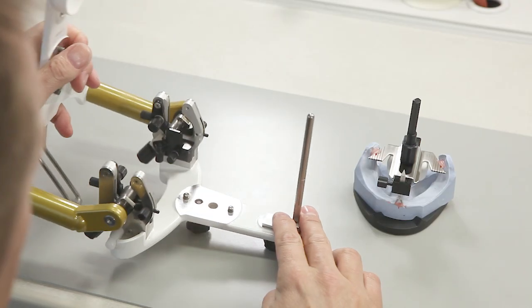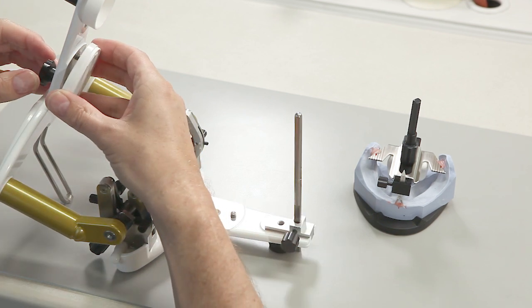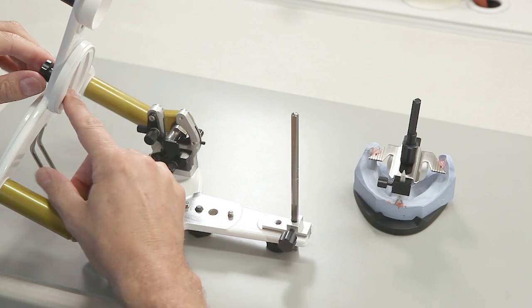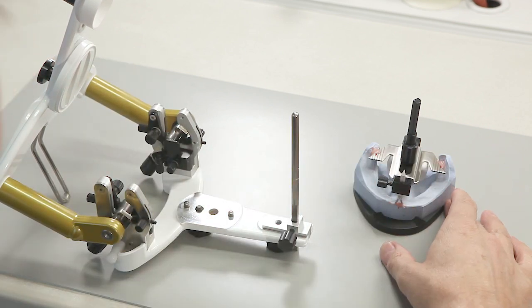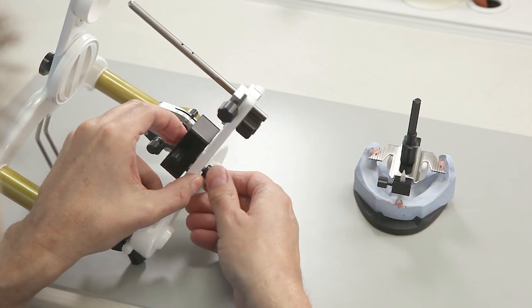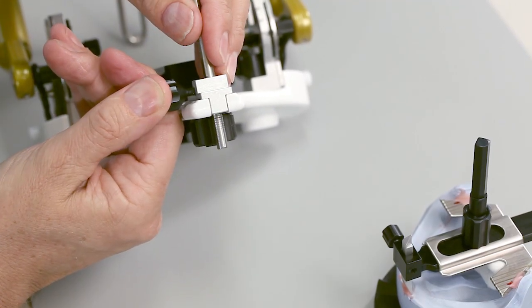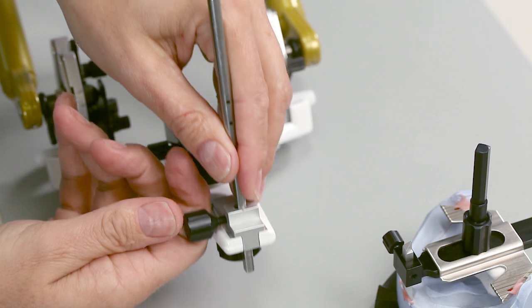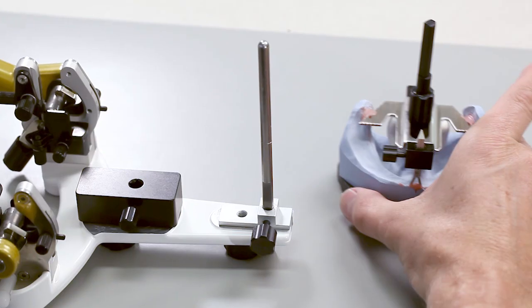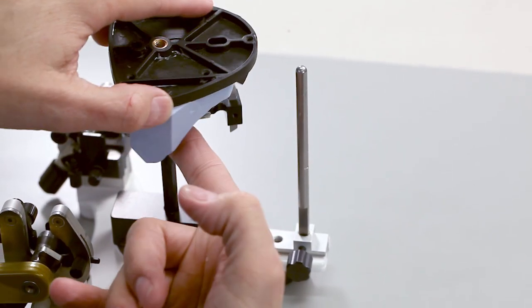Now the model can be mounted in the articulator. Screw the base plate for the lower jaw in place. Mount the instrument carrier in the upper frame base and fasten it with screws. Align the incisal guide rod to the red mark and secure it. It is now in the initial position. Insert the horizontal guide completely into the instrument carrier and secure it.